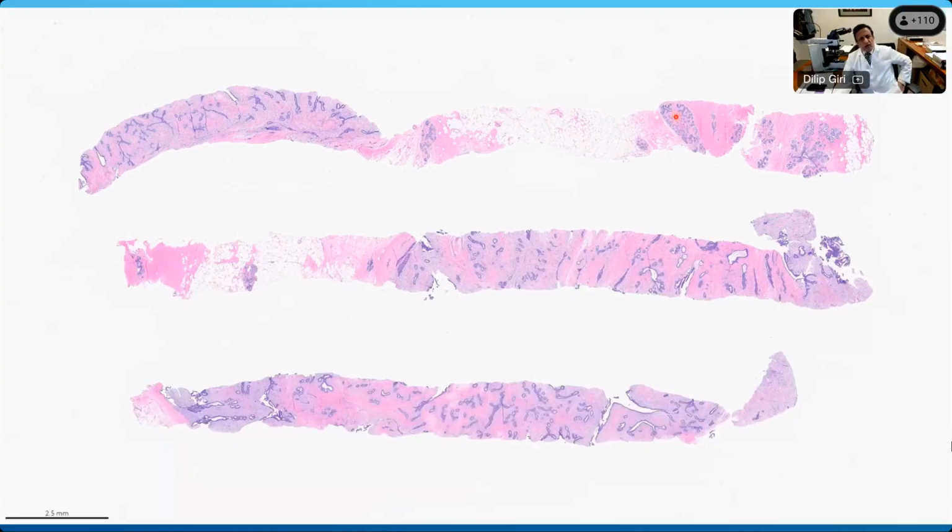So this young female had this core biopsy, which shows somewhat of a fibroepithelial kind of lesion where there is stroma and also ductal elements. So there is a combination of both stromal component as well as ductal elements. And at the edges of this particular lesional change, there is like a circumscribed face to it, right? So there are circumscribed edges.